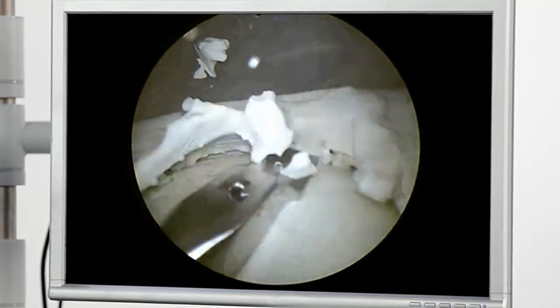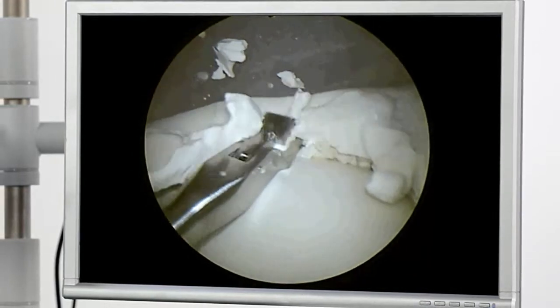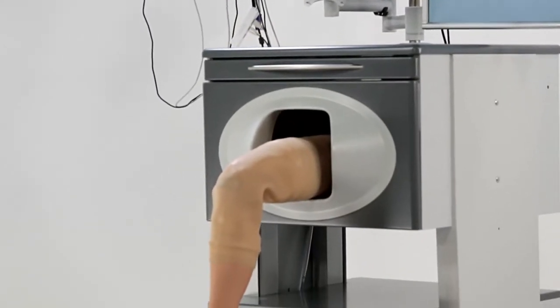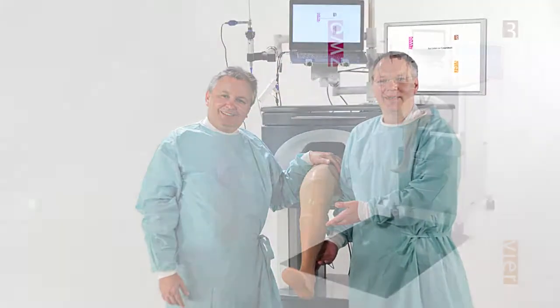Doctors can learn the techniques required for knee joint arthroscopy in clearly structured steps, without any pressure to achieve the intended results and free of any time pressure and fear of making mistakes. They can improve their skills in the interests of patient health and for the benefit of all those involved in the healthcare system.